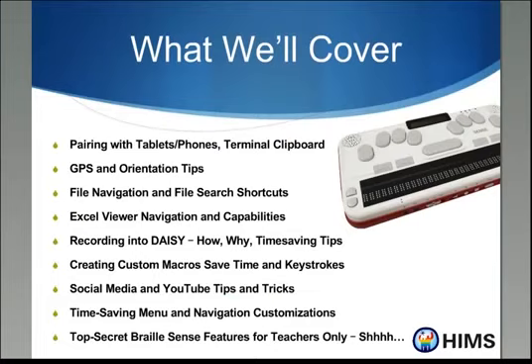We'll talk a little bit about pairing with phones, but we've got a document that outlines that in pretty excruciating detail, so you can always send a message to webinars@hims-inc.com, and we will be happy to send you instructions on how to pair your iPhone, Android device, Mac, PC, whatever, with any of our devices. We are going to talk about the terminal clipboard, which is a really neat way of entering text into your iDevice without some of the weird translation issues that you can run into when you're dealing with iOS devices.